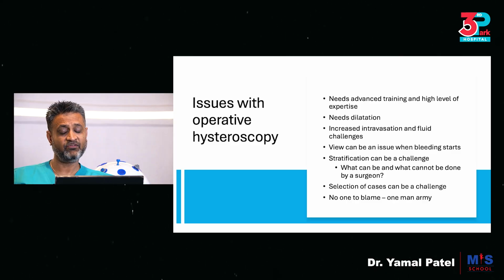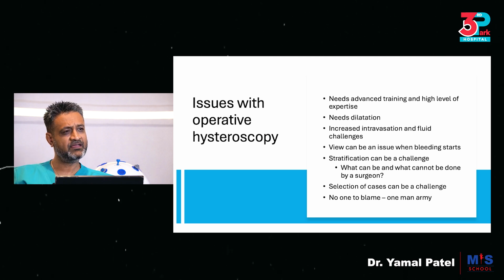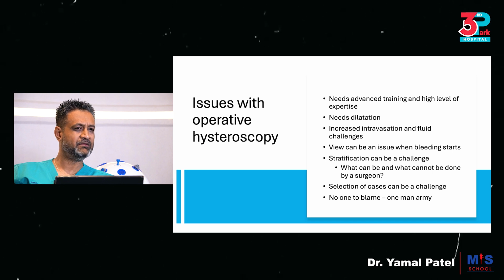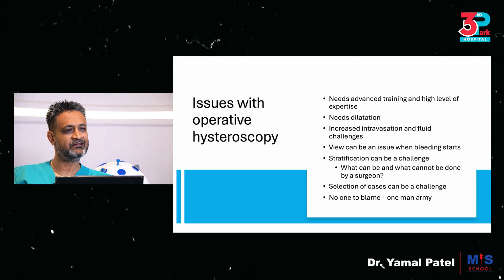You can't police what someone does and does not do, but I think it becomes a self-initiative, and conscience should tell us that this kind of procedure may need additional specialist care, and I could refer them to somebody else to do them. It's probably beyond me. Selection of cases can be a challenge. Therefore, is it that you cannot do it, but you tried it? Or is it that you were probably not able to select properly because of a diagnostic error, and therefore you went in and only realized that it's now more complex than we thought?